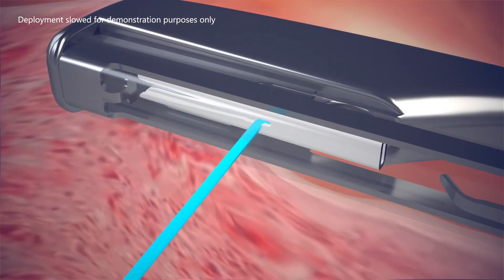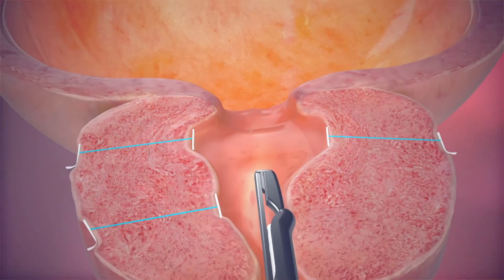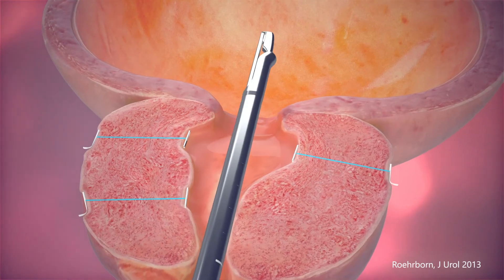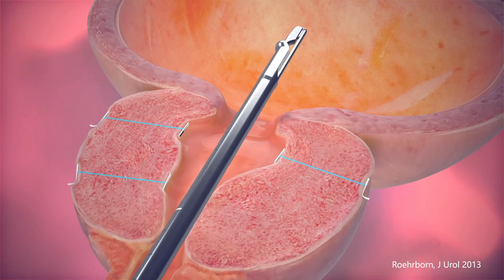As the suture is tensioned, it also shortens, compressing the prostate lobes to the side. This reduces pressure on the urethra and provides immediate, visible results so urine can flow freely. It's a mechanical solution to a mechanical problem.